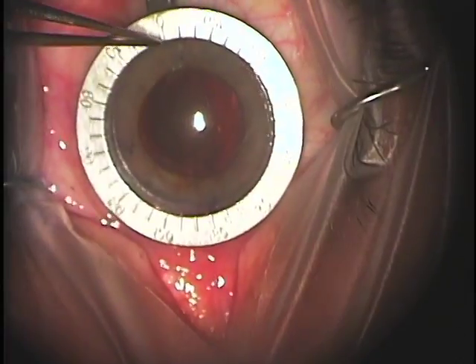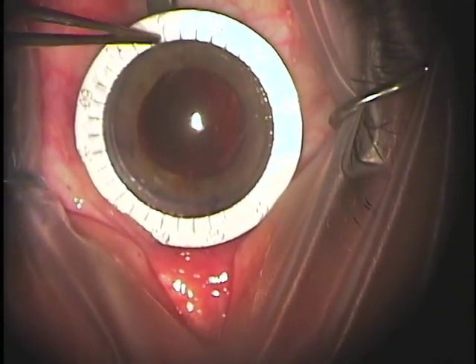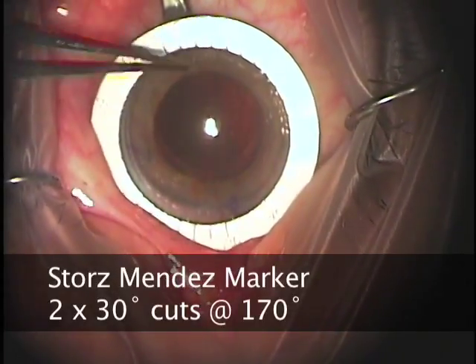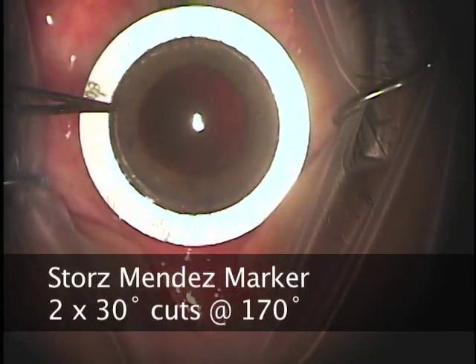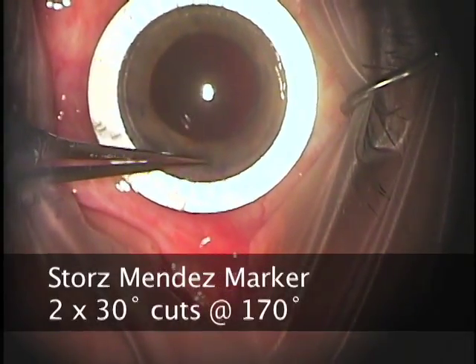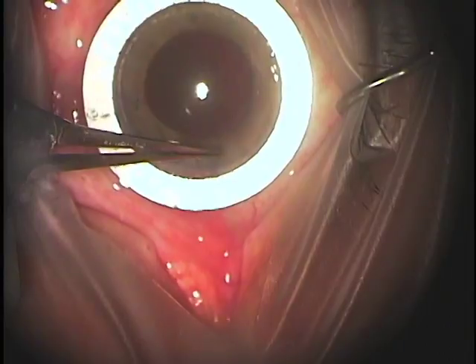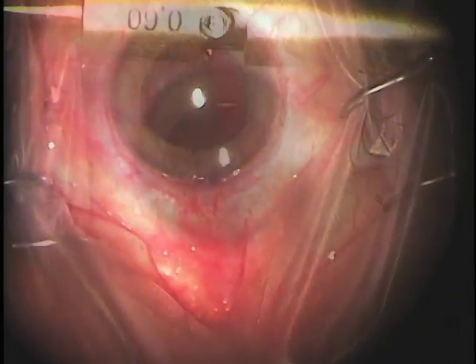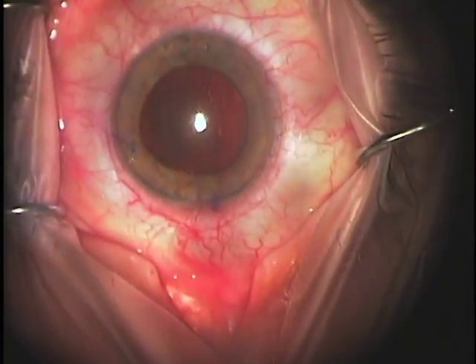Each minor mark on the Mendez marker corresponds to 10 degrees, so sometimes you have to interpolate or estimate when the desired axis falls in between. Here we're making two 30-degree cuts centered at 170 degrees, the steep axis. I'm using 0.12 forceps to indent the cornea as a mark. First, we'll find the axis where the LRI will be centered. Then we'll make a mark on each side of that axis to show the beginning and the end of the LRI cut. For this 30-degree cut, I'm marking the cornea 15 degrees on either side of the steep axis.